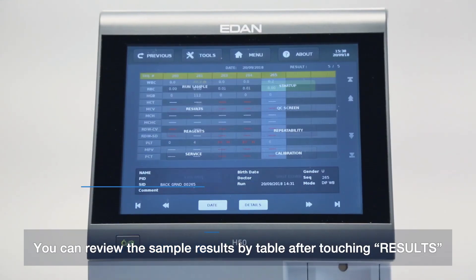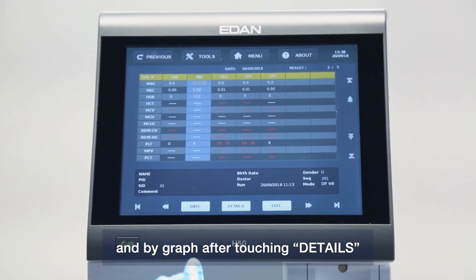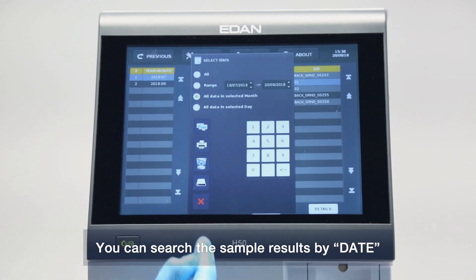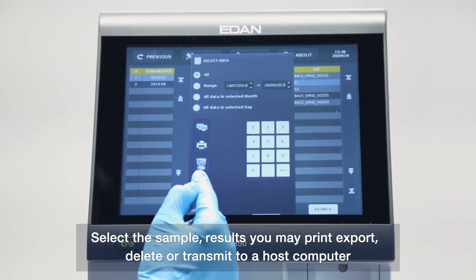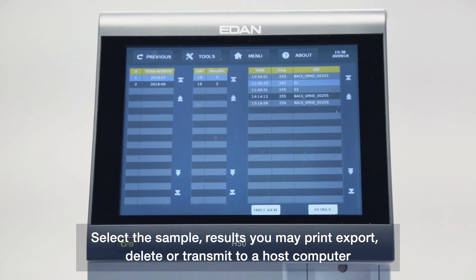You can review the sample results in table form by touching Results, or in graph form by touching Details. You can search sample results by date. After selecting sample results, you may print, export, delete, or transmit to a host computer.